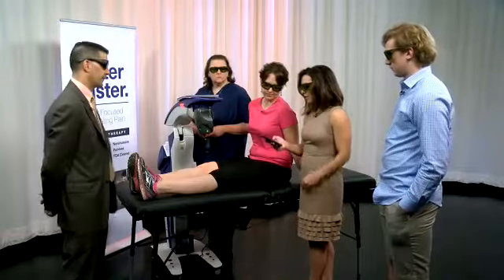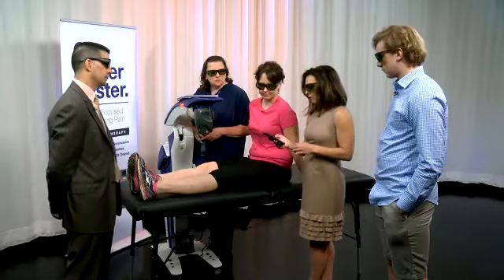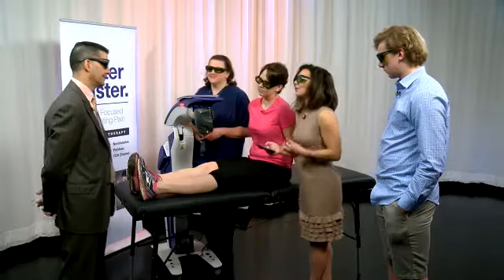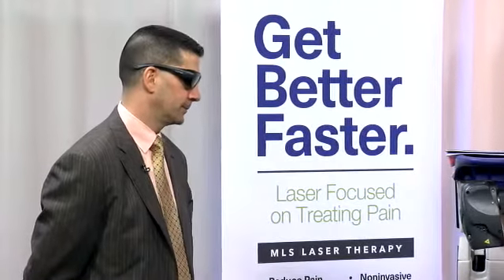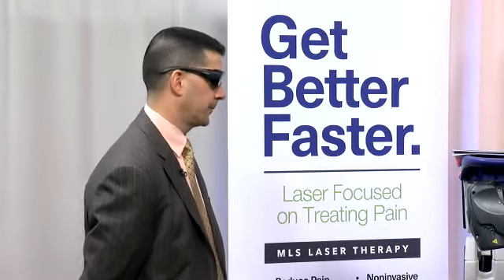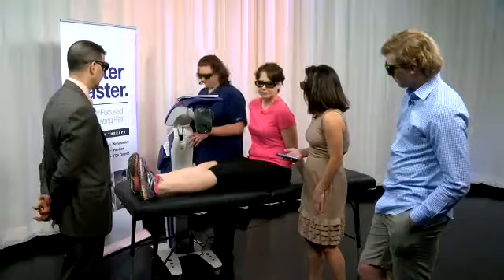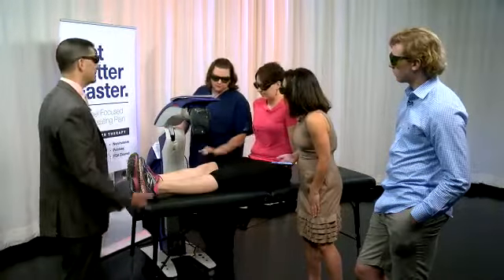Colleen is asking if insurance will ever cover this. I have no idea — that's a hard question. Gail, how does it feel? I don't feel a thing. That was a treatment right there — about six minutes on her. Usually we would do the front of the knee, and then you might do the back of the knee. She might lay on her belly and we do the other half for another six minutes so we're getting the entire knee — front and back — with penetration of two and a quarter inches.